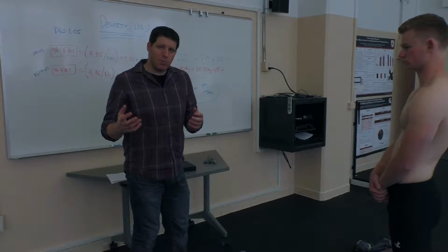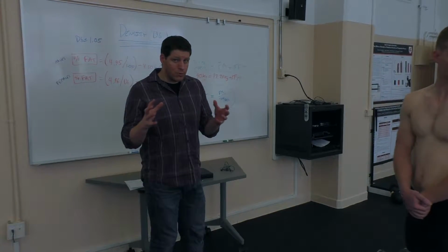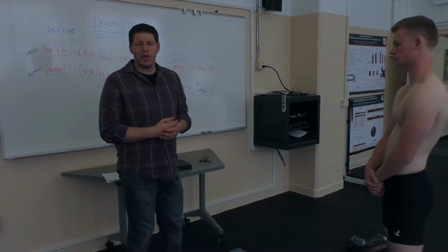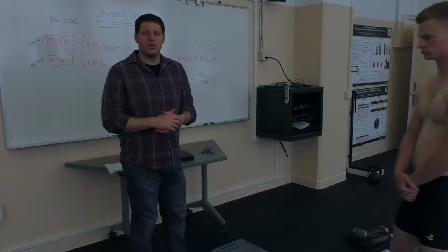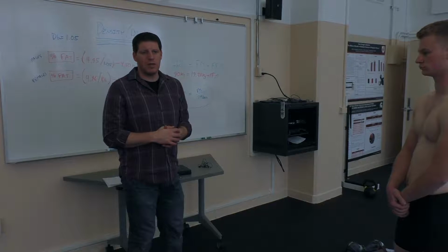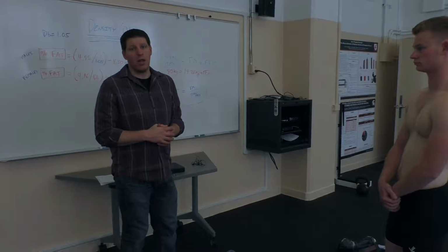The question that I would pose to anybody that argues BIA's overall merit without noting its limitations is whether or not a quick and easy number is any good if we're not certain that it's valid or accurate. So take these things into consideration. I don't believe these devices are universally bad, but I also believe you should be very, very cautious when interpreting any kind of data from them and ensure that the participant is well hydrated.